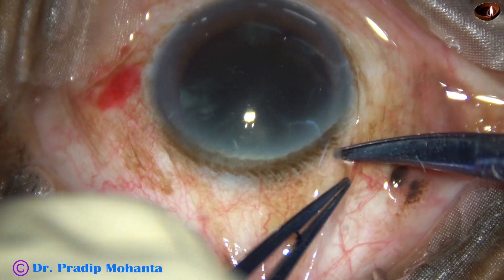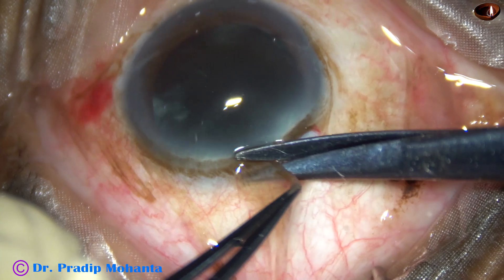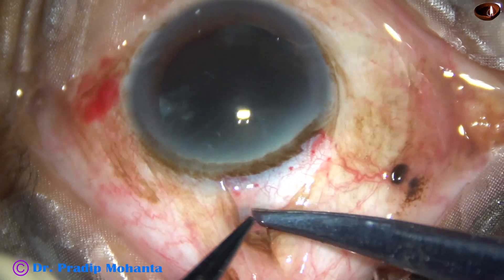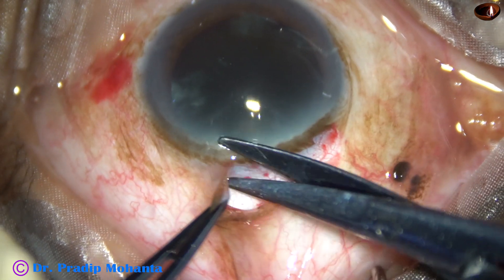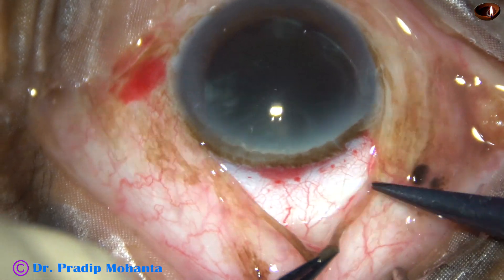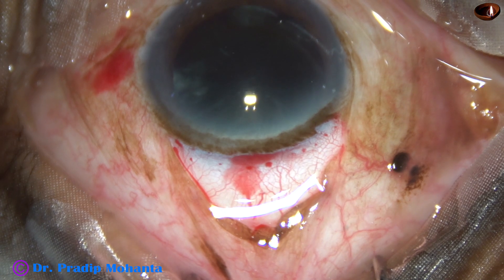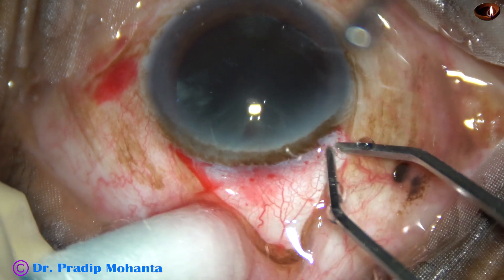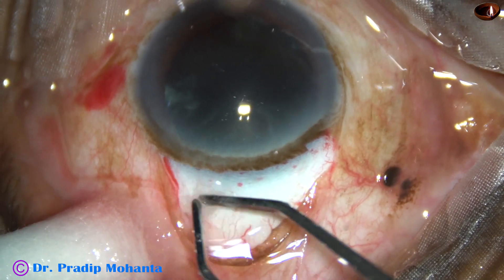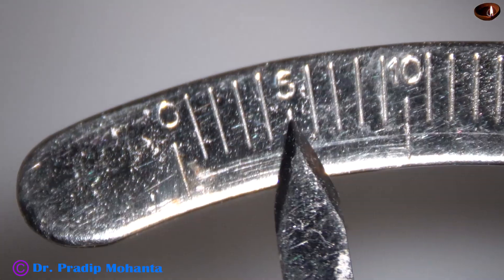I am doing conjunctival peritomy. In this case, there is very thin Tenon's tissue and I can take Tenon's and conjunctiva together. In some cases, the Tenon's is so thick that you have to dissect it as a separate layer, but in this case it was not so. And now, bipolar wet-field cautery is done — very mild cautery. Care is taken not to cause any contraction or charring of the surface of the sclera.